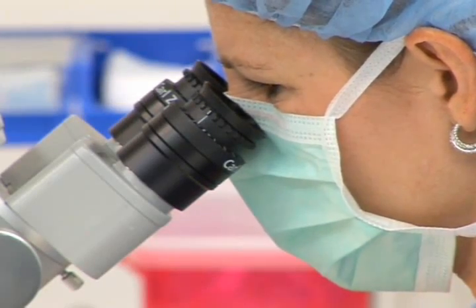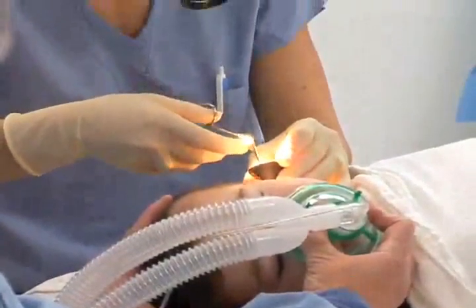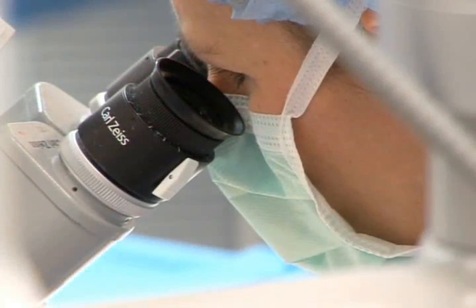A speculum is inserted into the ear canal in order to open it for visualization of the eardrum. There's oftentimes debris in the canal, such as wax, that needs to be removed before we can perform the procedure. Once we have the eardrum in good view, we choose our location to place the incision.